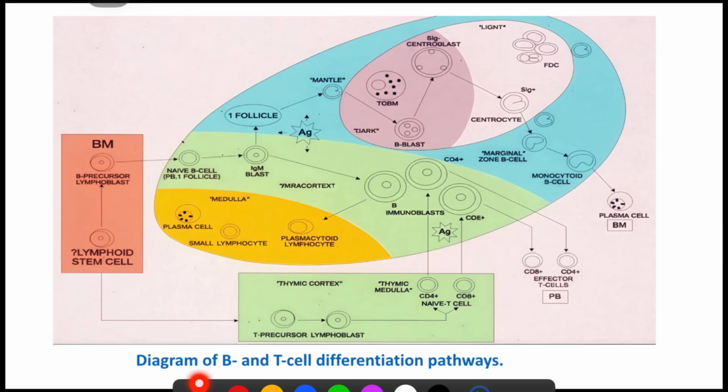Now, after these cells reach the germinal center, the germinal center formation begins with the entry of these IgM blasts into the primary follicle to form centroblasts, right. So, as the proliferation continues, centroblasts migrate to a more peripheral zone. Here you can identify these are the cells going to the mantle zone.